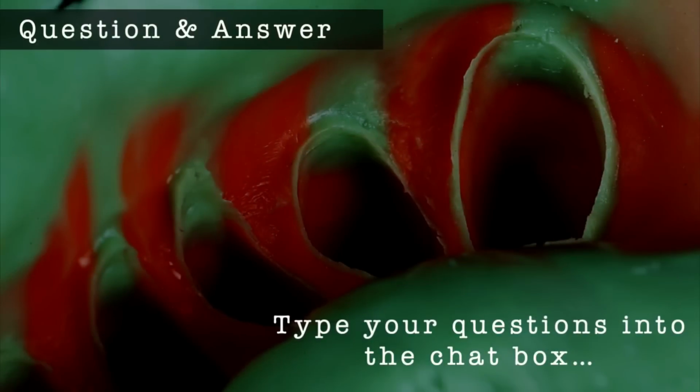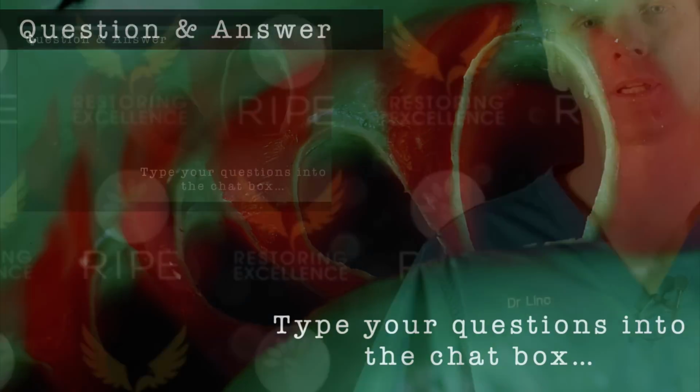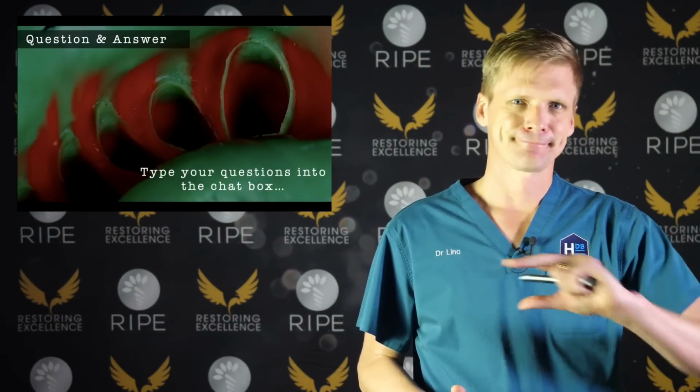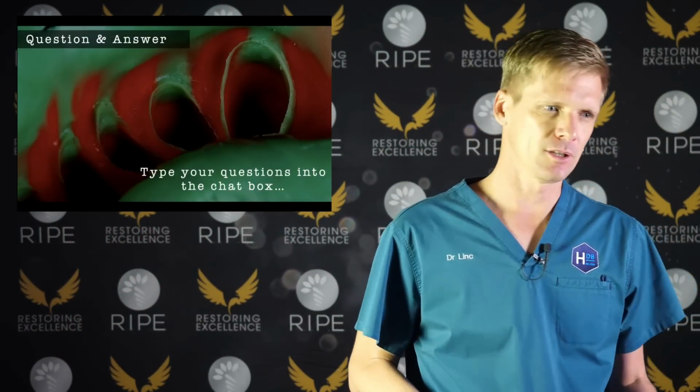Waleed has sent through a question. How about packing cotton pellets soaked in hydrogen peroxide? Can it help stop bleeding? It can help stop bleeding, but it doesn't do a very good job. Compared to using Viscostat Clear, it's not even close. I used to use hydrogen peroxide. It's not very good. Okay, yes, you can use it.